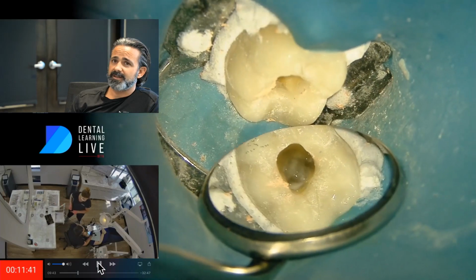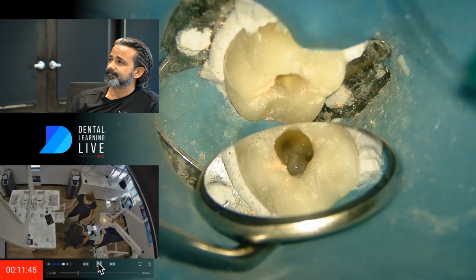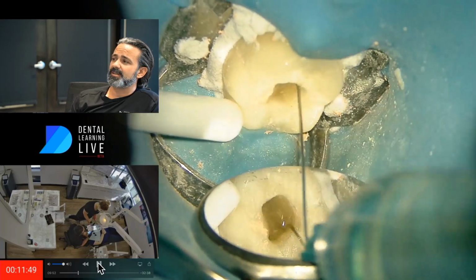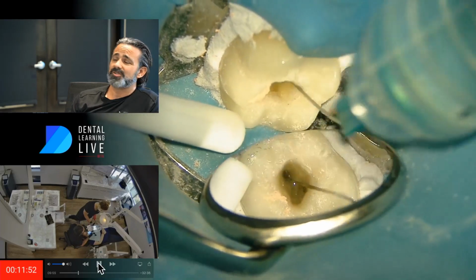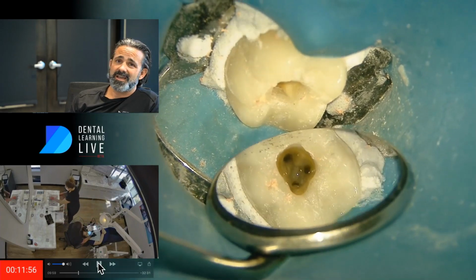And still finding remnant gutta percha. Now I've switched to hypochlorite, and my logic here is I want to see if there's any tissue in there, and if I can actually see something at this point, just to see if anything effervesces.